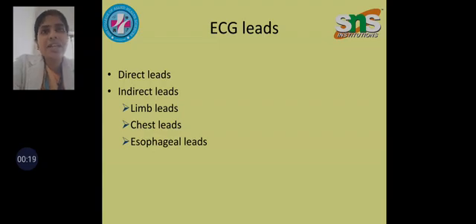Electrical activity between one positive pole and another negative pole. That is, between two poles lies an imaginary line representing the lead's axis, and the term refers to the direction of current moving through the heart. So the direction of current affects the direction in which the waveform points on the ECG. When there is no electrical activity, or it's too weak to measure, the waveform looks like a straight line. It is also called an isoelectric waveform.